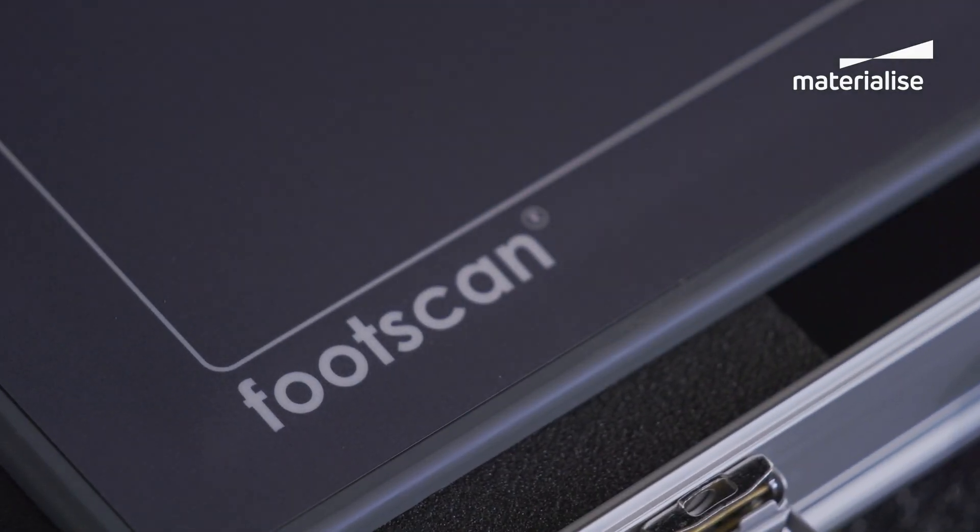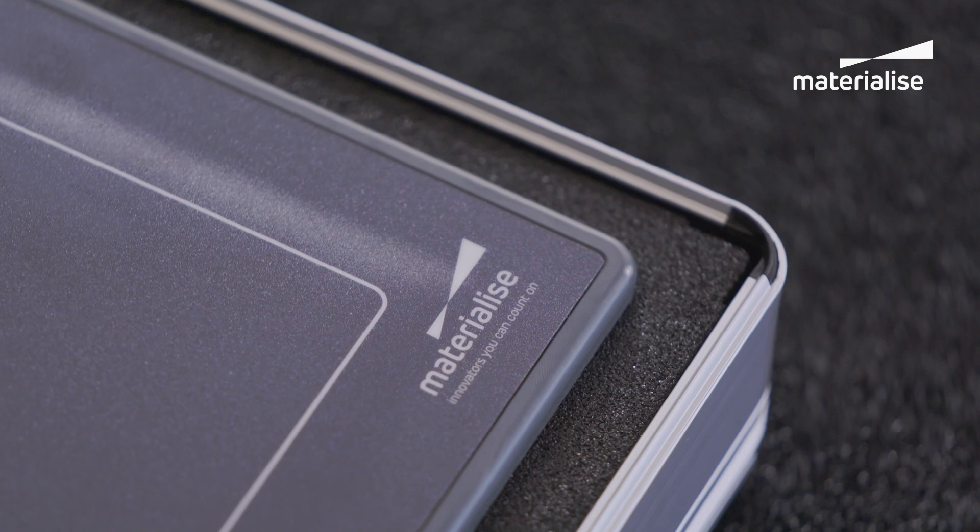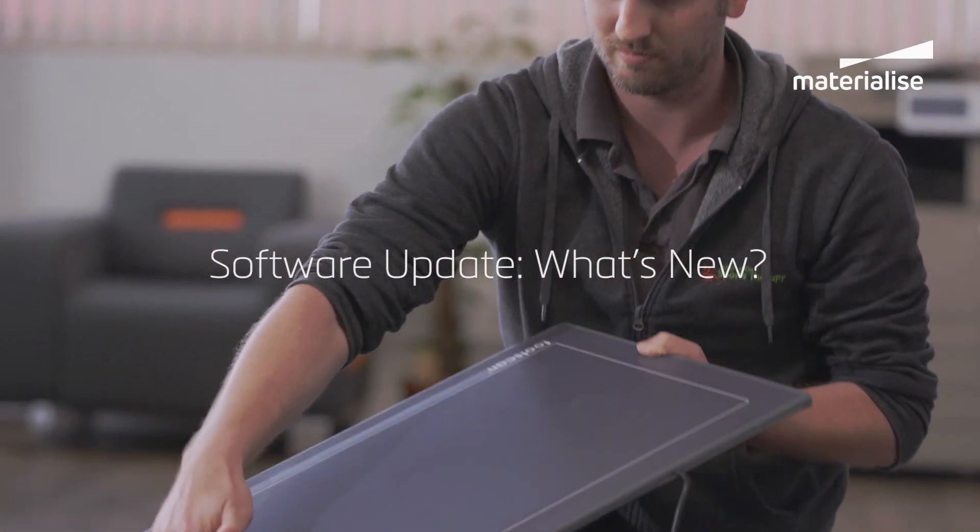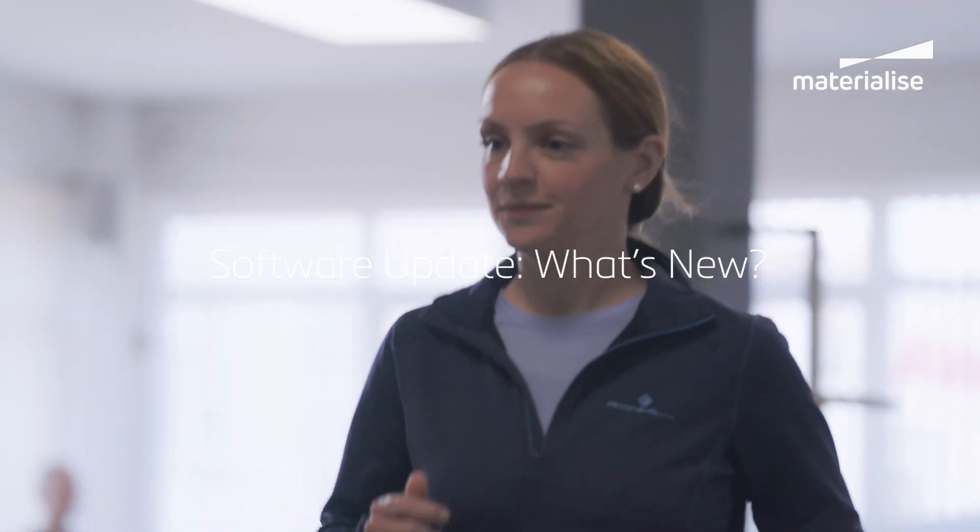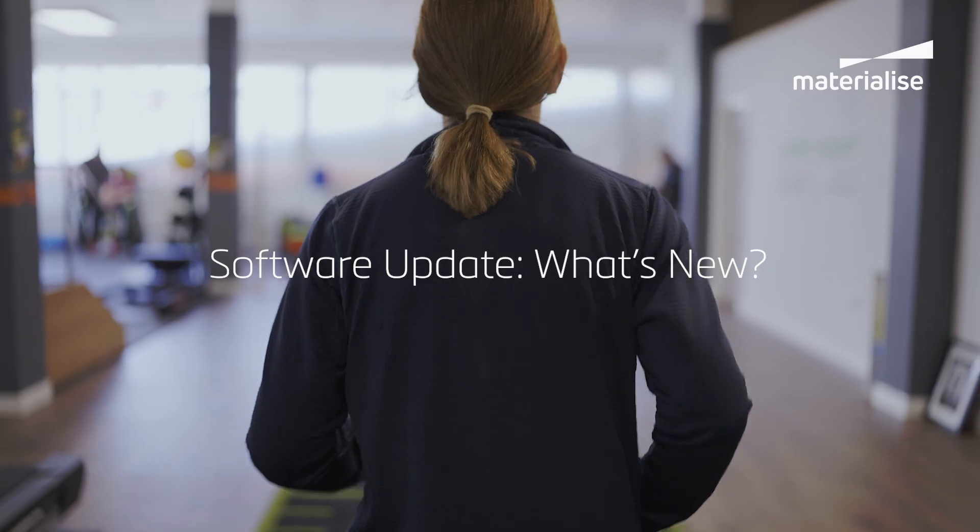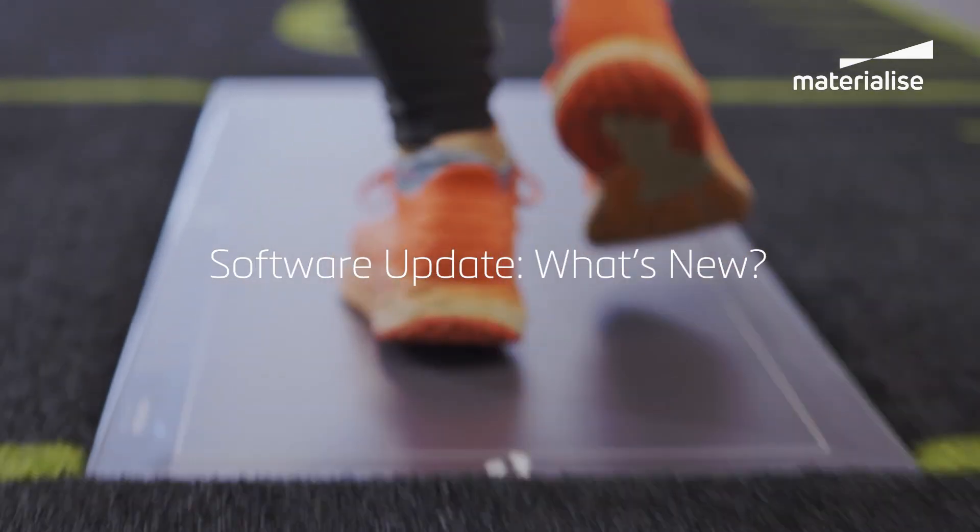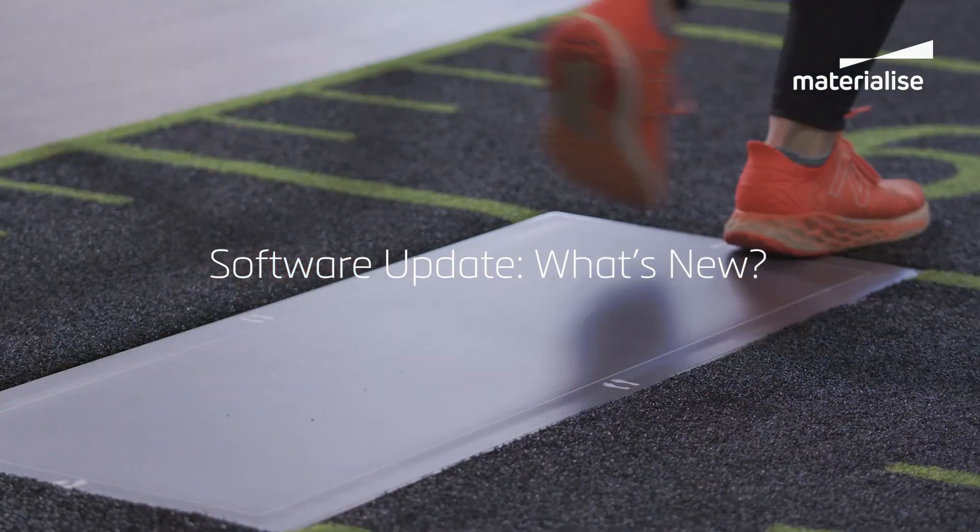Welcome to the latest update of our Footscan software. Designed to make your experience smoother, faster, and more effective, let's look at what's new.